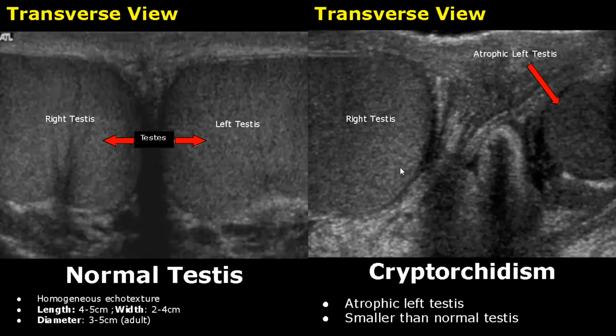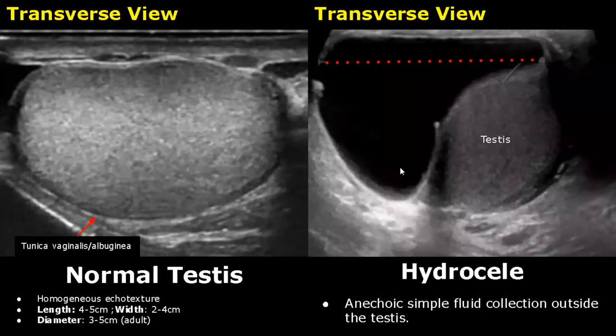In a hydrocele there is an anechoic fluid collection seen outside the testes. You can also notice posterior acoustic enhancement over here.